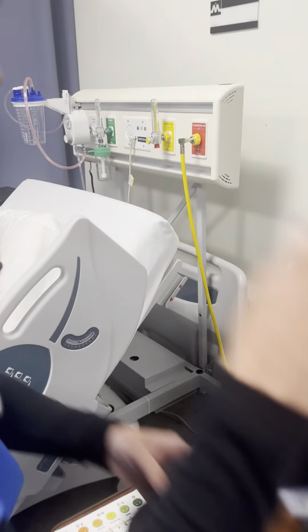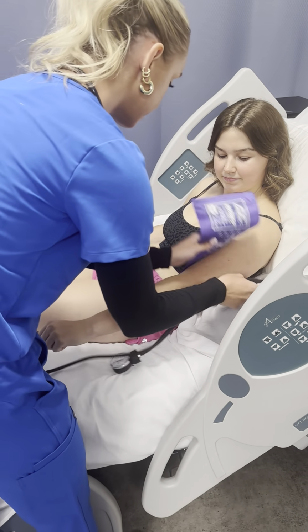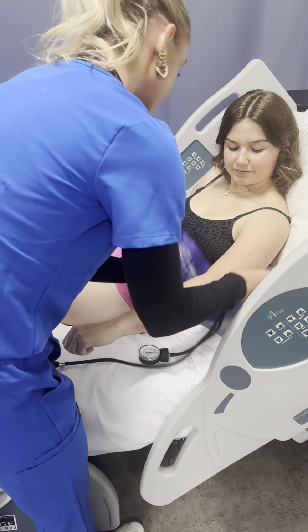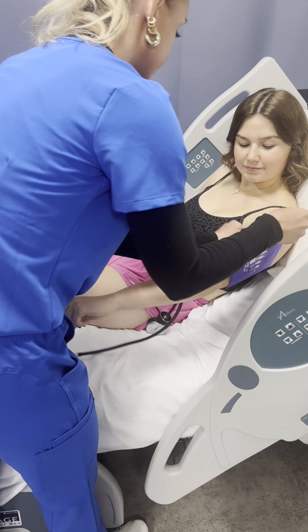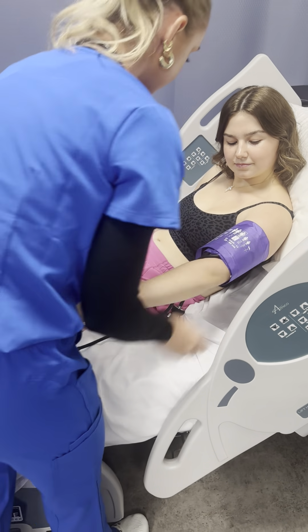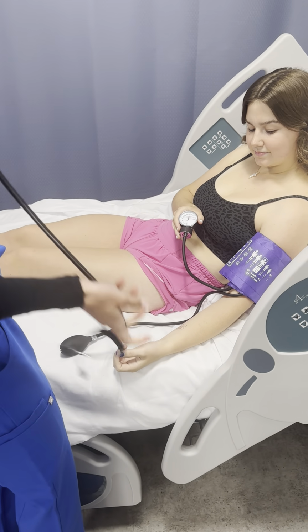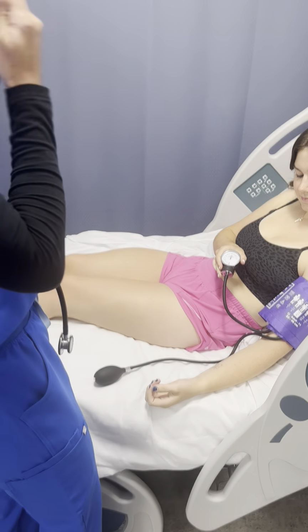Okay, and your pulse oximetry was at 99. Now that we gave your arm a little bit of a break, I'm just going to do your actual blood pressure now, okay? Same thing on the same arm. Perfect. Would you hold this for me again? Yes. Thank you so much. And I'm just going to listen with my diaphragm.